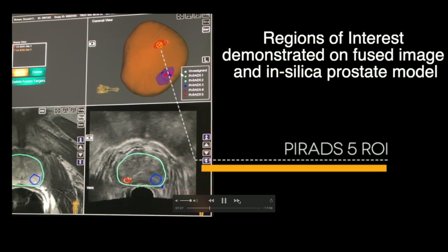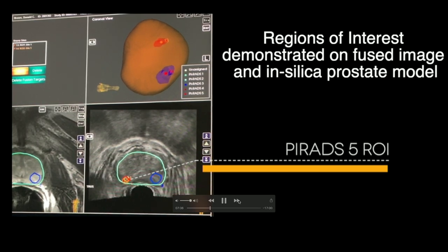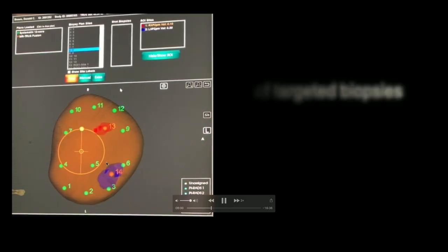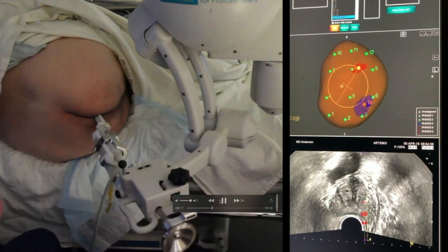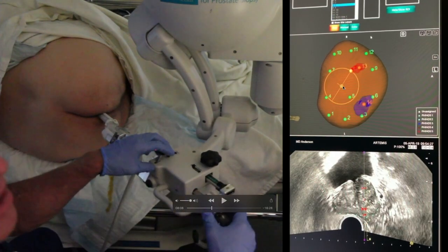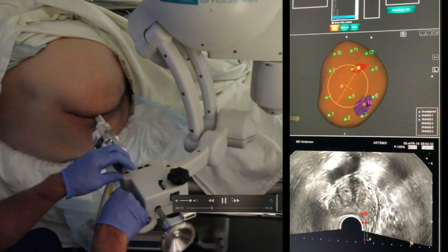This is the first time you start to see the regions of interest. Once you see the regions of interest with the fused models, you can start planning your biopsy. You can see how within the model on top, which is the computer-generated model, and the ultrasound image below, you can see these targets. One thing I want to point out: I would rather have this pivot rotation a little bit further towards the apex because it gives me a broader ability to reach all aspects of the prostate if I'm pivoting right on the middle of the prostate.